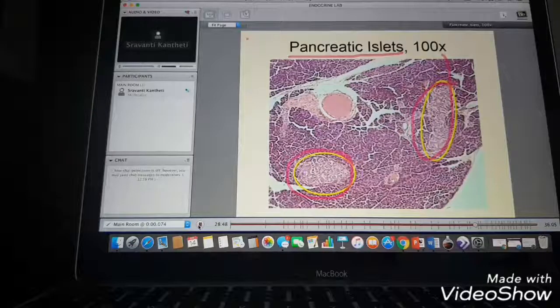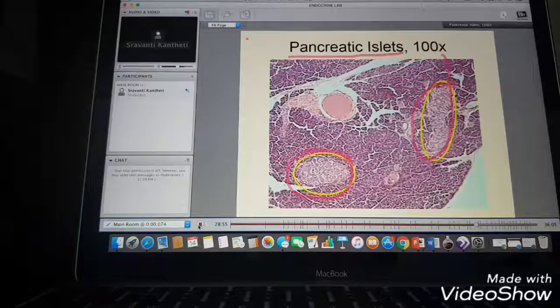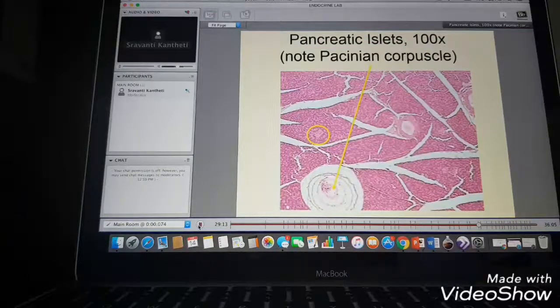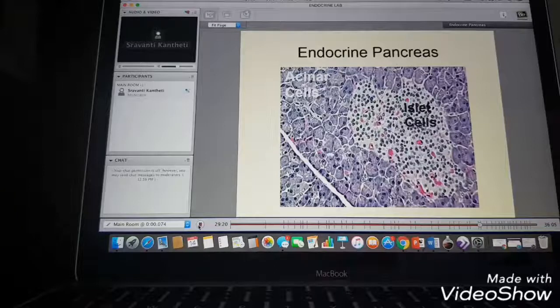I think Langerhans only has one A. I don't remember off the top of my head, but islets of Langerhans, this is the guy who just invented it, because back in the day, men did a lot of looking under microscopes, apparently. So when they discovered something, they put their name on it, right? That's how you do. So islets of Langerhans has specific type of cells that are releasing hormones. So you will see bundles of cells within the pancreas that do this.